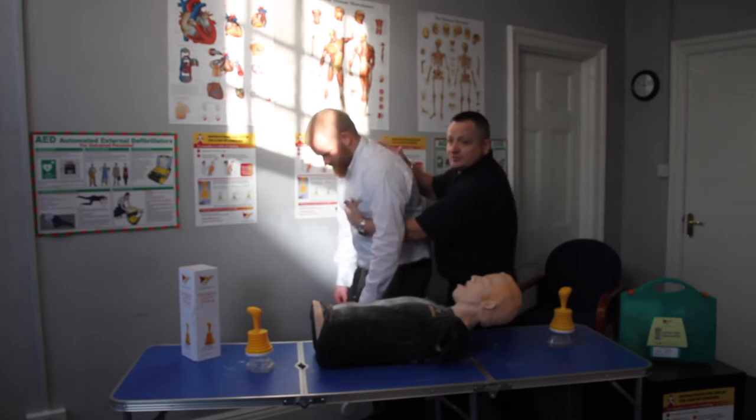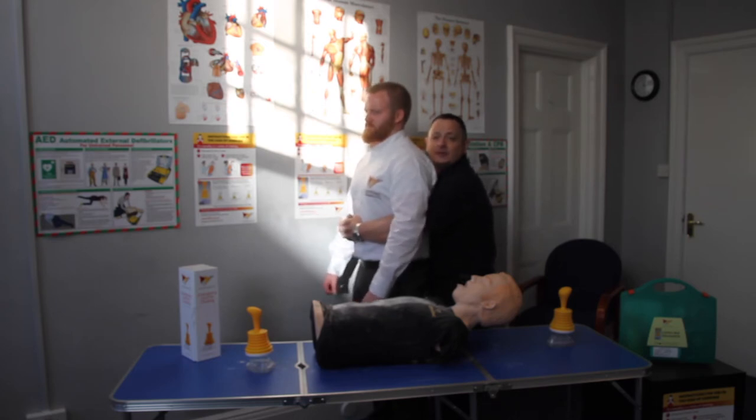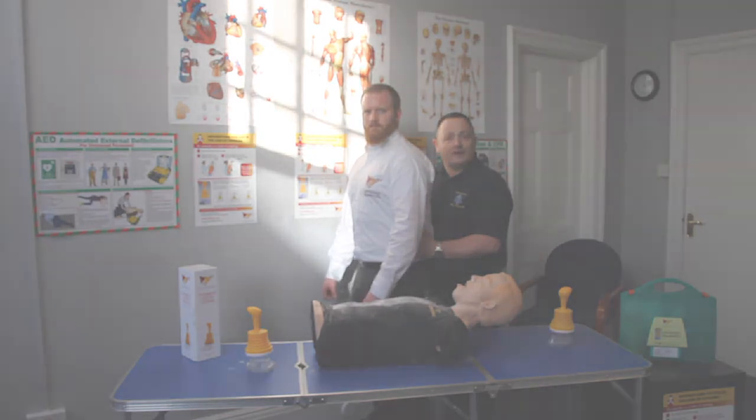Again, checking the obstruction. After five times, if this hasn't worked, I'm going to put my hands around their stomach, making a fist just above the belly button, other hand to it, and deliver a sharp pull in and upwards to hopefully dislodge the blockage. I will do this, if necessary, up to five times. If this fails and the protocol so far has failed, I will now get the assistance of the emergency services by calling 999.